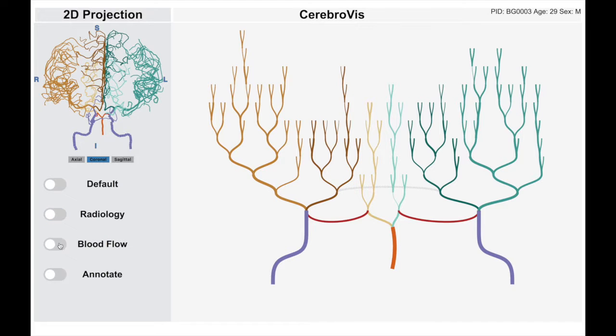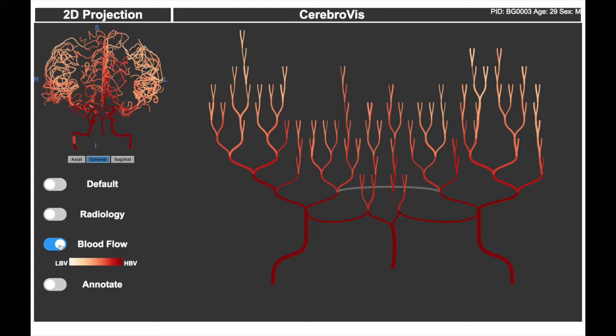Additionally, the edges in the cerebral network can encode blood flow. Since we do not have blood flow data, we demonstrate the feature with a simulated blood flow model.